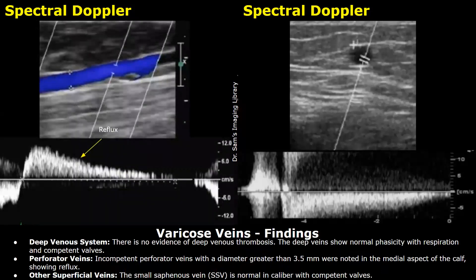Deep venous system: there is no evidence of deep venous thrombosis. The deep veins show normal phasicity with respiration and competent valves.